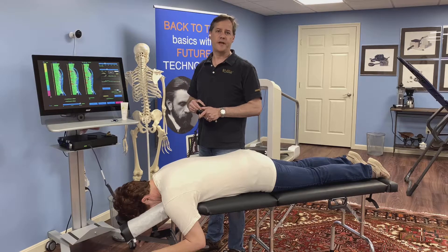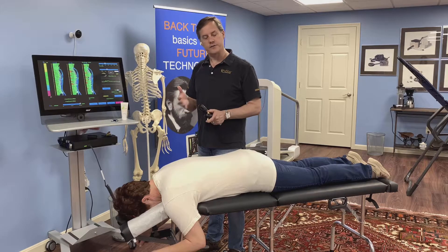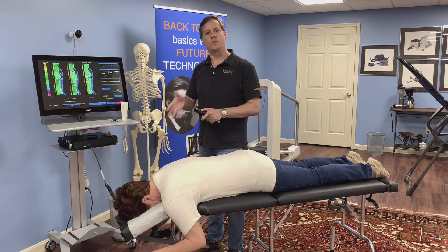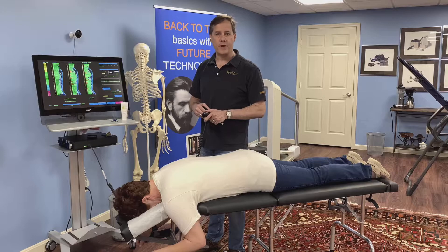During this COVID-19 crisis, some states have deemed massage therapy to not be essential, but many chiropractors still want to use some massage to relax muscles in different areas of the spine. With the Pulse Star, you get a soft tissue system as well as a basic analysis and adjusting system for the spine.